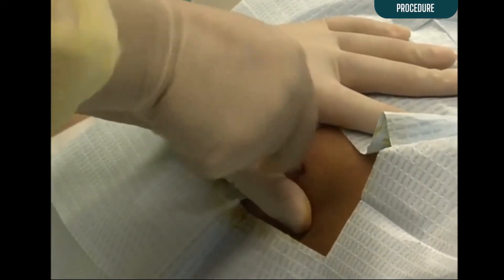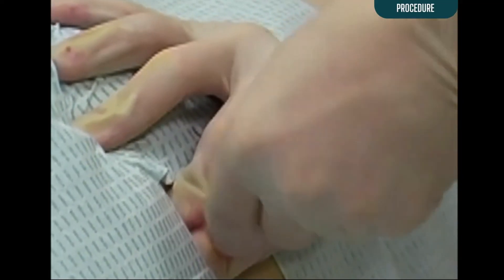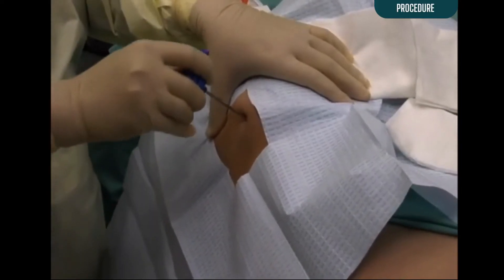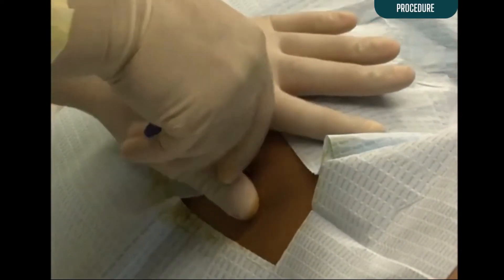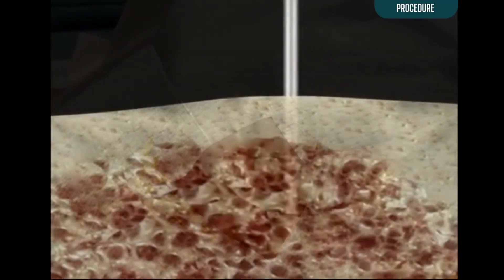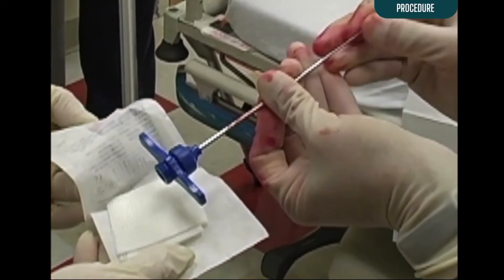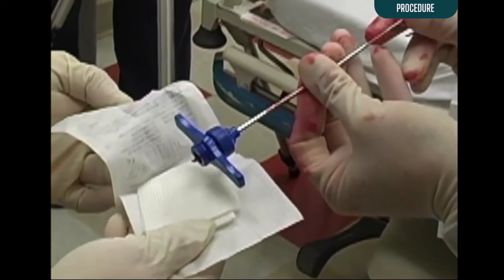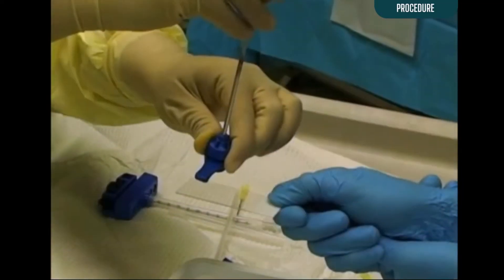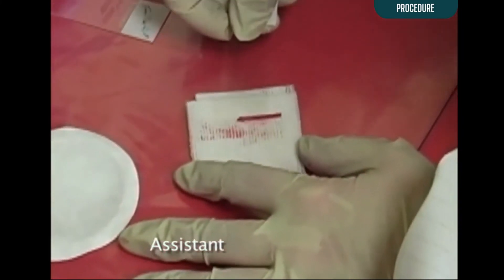Rotate the needle 360 degrees several times in both clockwise and counterclockwise directions prior to removal. The needle should then be rocked back and forth to ensure detachment of the specimen from surrounding marrow. Slowly pull the needle out while continuing to rotate. Remove the specimen from the needle by inserting a sterile probe into the distal end of the needle and push the specimen through the hub onto sterile gauze or a slide. Inspect the specimen for adequacy of marrow.